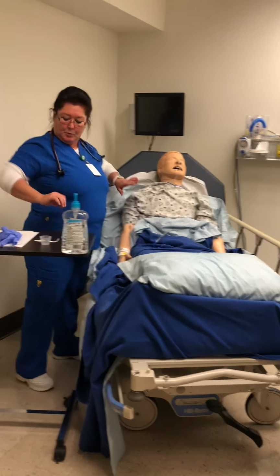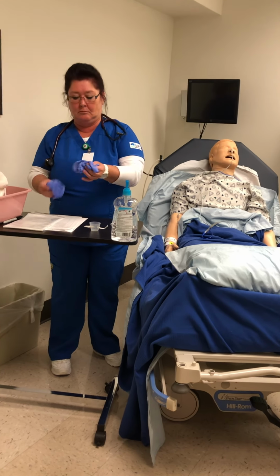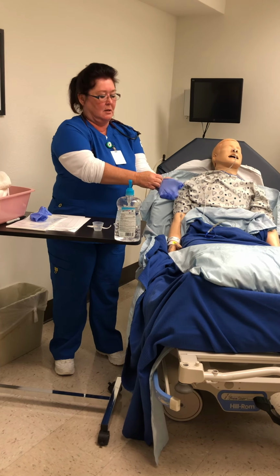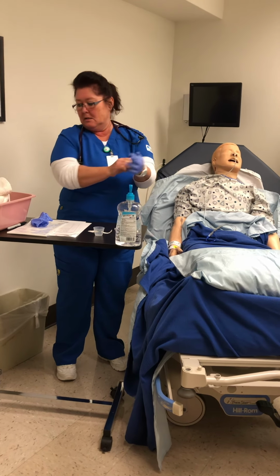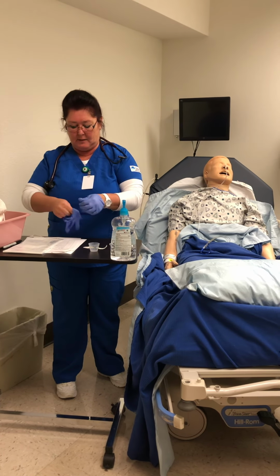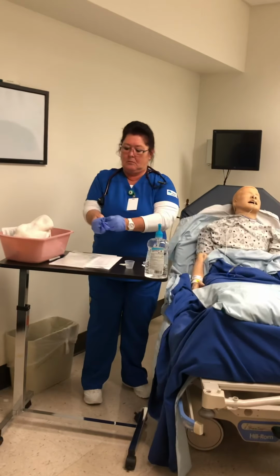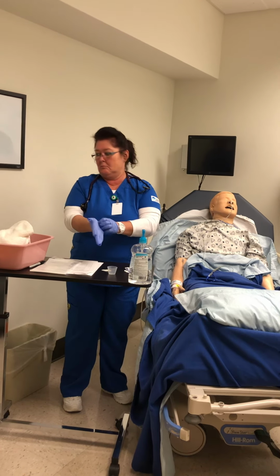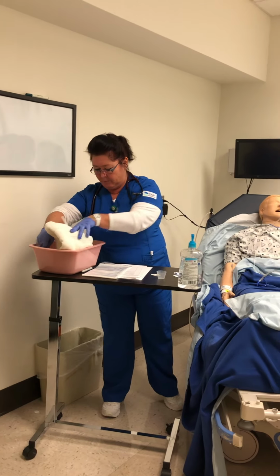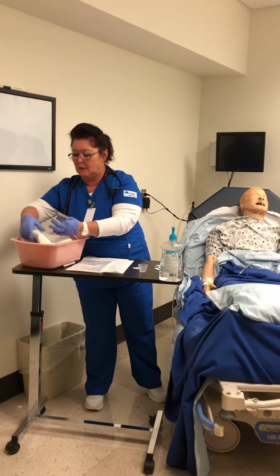Okay, so at this point, I'm going to don gloves again, and I am going to check the acidity of her stomach as well as check the color and the consistency of the gastric juices. And I'm going to get my litmus paper. And the chart.